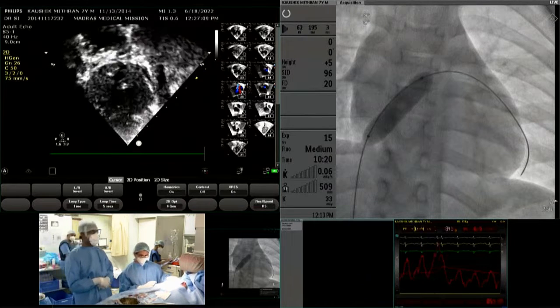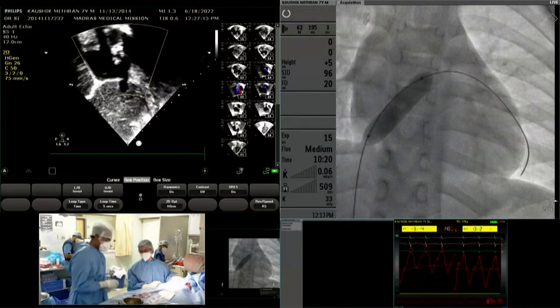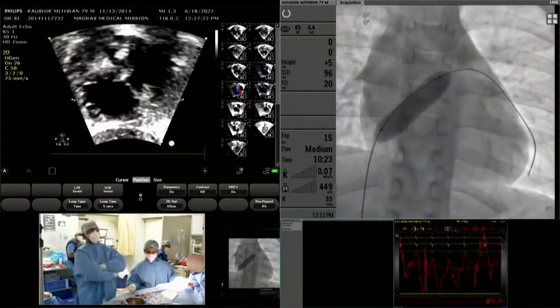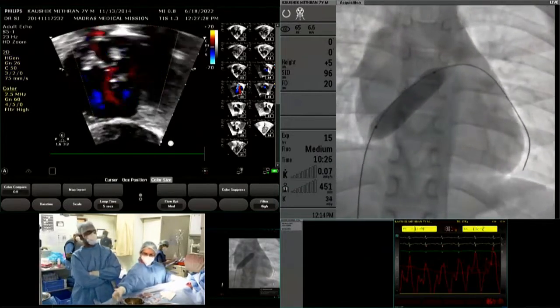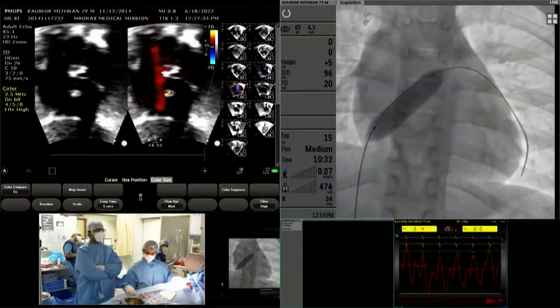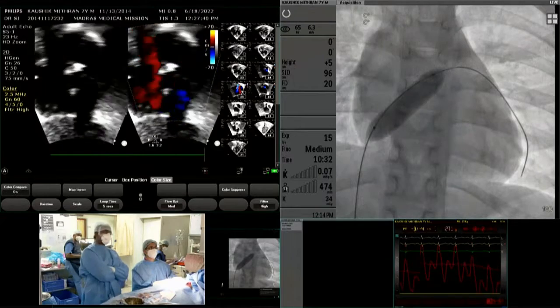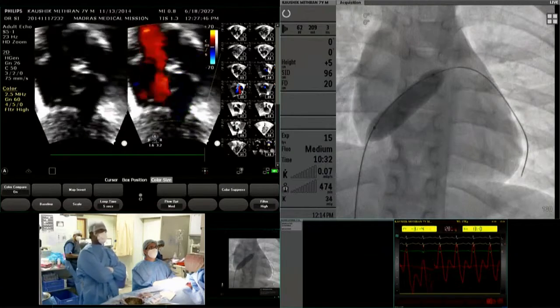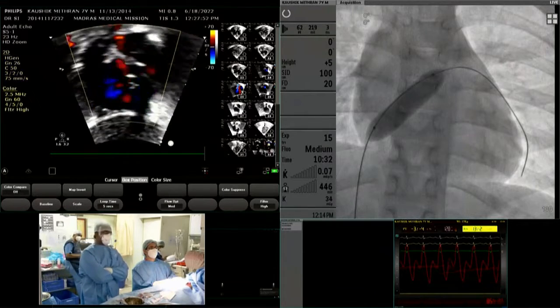In fact, I am going to do that now. What is this balloon size? Now if you put a color, I'm seeing an inferior where the IVC is joining, it appears that there is a small hole. Dr. Sushil is telling that close to the SVC. Yes, we see there is a color flow, probably adjacent to my balloon, right, Pramod? Yes, sir, it's adjacent to the balloon. It may be possible that there are a few fenestrations in that area.